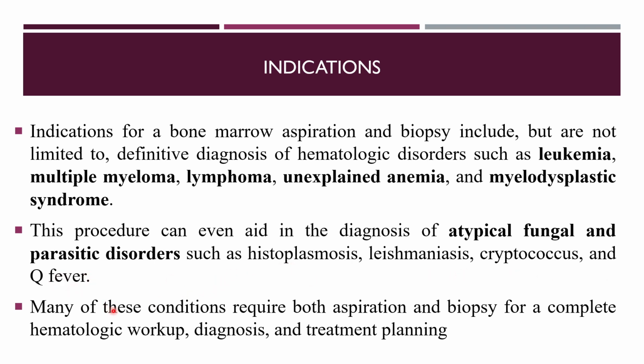Some of the conditions which I have just explained require only the aspiration, and in some cases we may also need to take a biopsy sample as well. So both aspiration and biopsy together can be sufficient to diagnose such conditions. Okay.